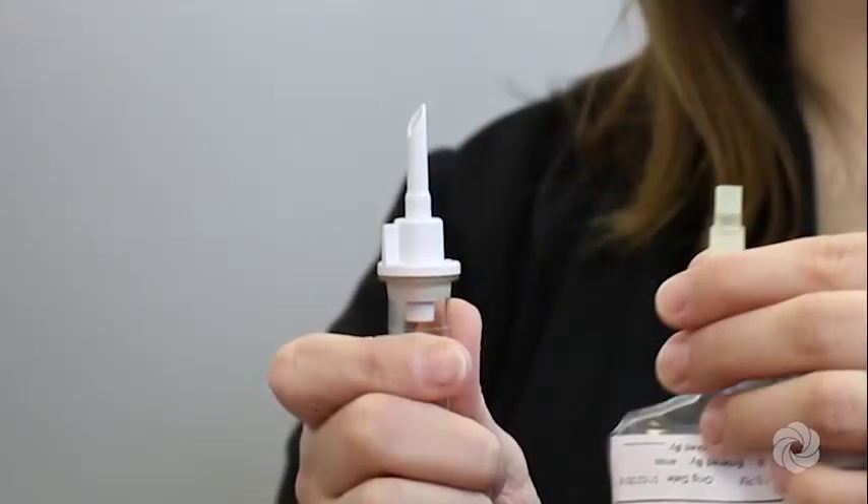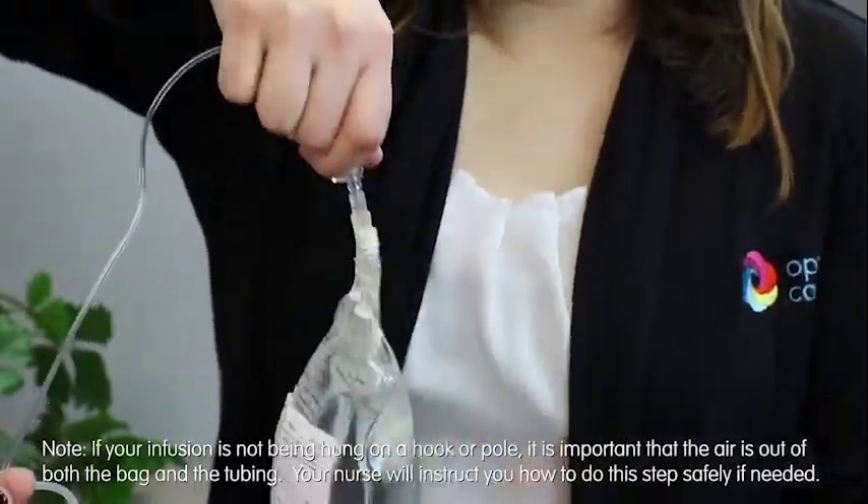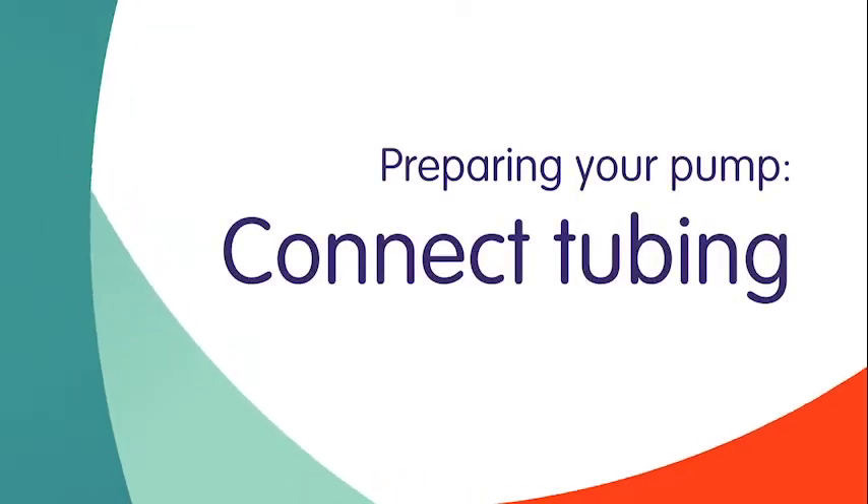Being careful not to touch the end, spike the bag by pushing and twisting the end of the tubing into the bag port. Make sure the spike reaches the medication and does not puncture the bag. You are now ready to connect the tubing to the pump.